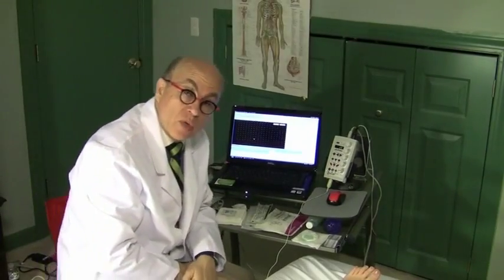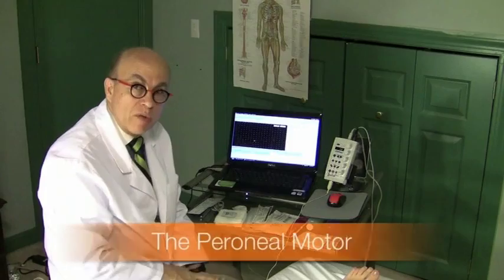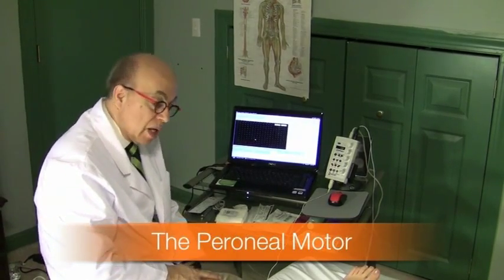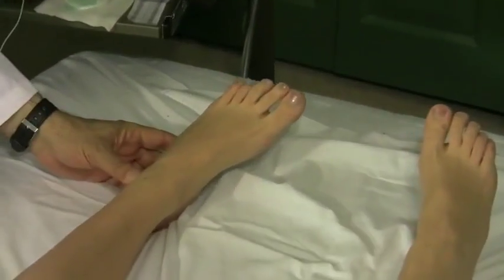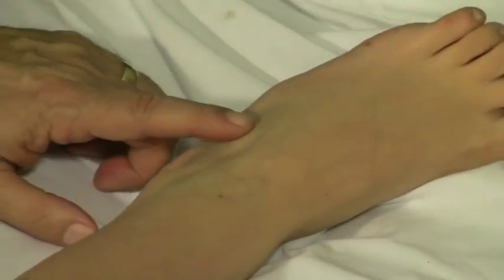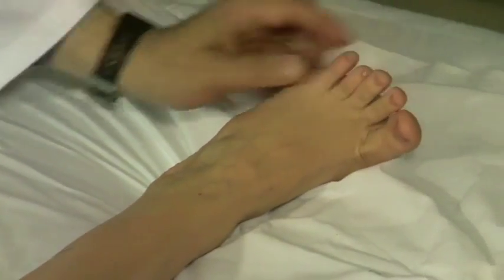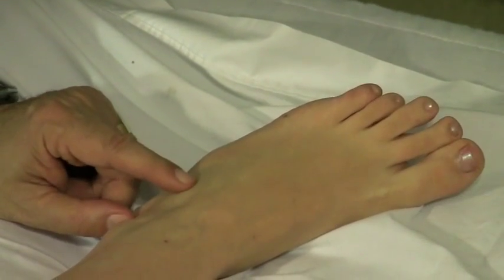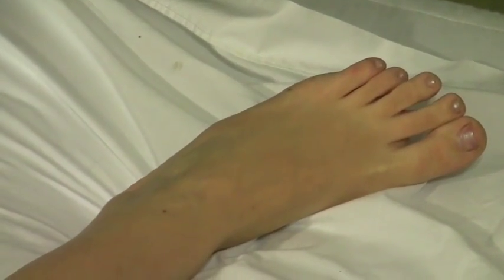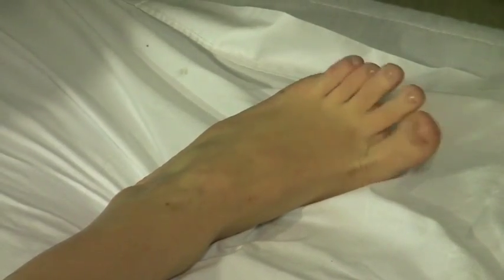The next nerve we do in the lower extremity is the peroneal nerve, the peroneal motor this time. And the peroneal motor we record from a muscle called the extensor digitorum brevis here. This is the muscle here, and that's really the dorsum of the foot. It bumps up when you ask the subject to point their toes towards their nose. Now relax, point your toes up, relax. You see, that's where the muscle is. And as I see it contracting, bend your toes up.